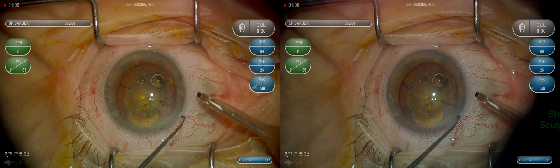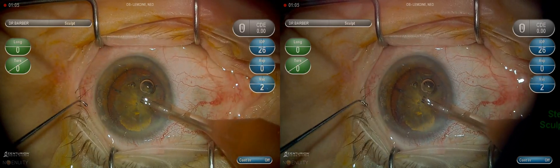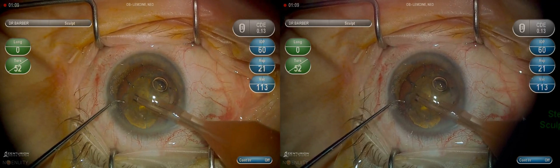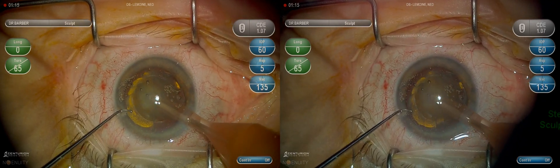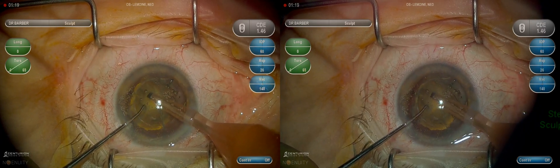Here we are with phacoemulsification using the Alcon Centurion unit, clearing some working space by removing the viscoelastic and now creating a central groove. Using the second instrument and the phaco needle to crack the nucleus.